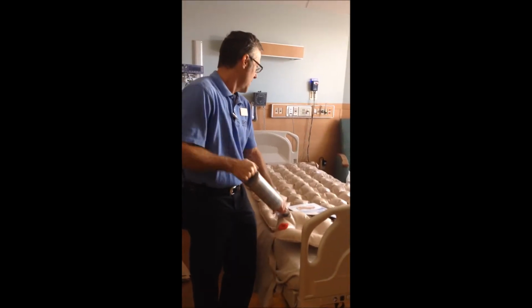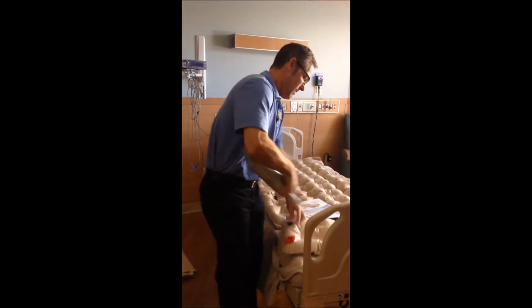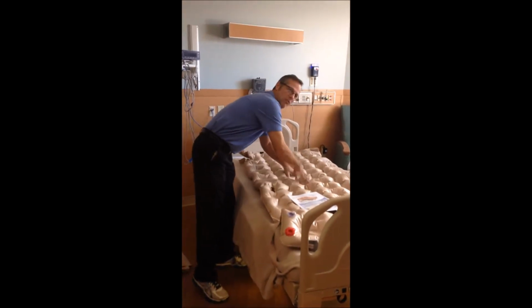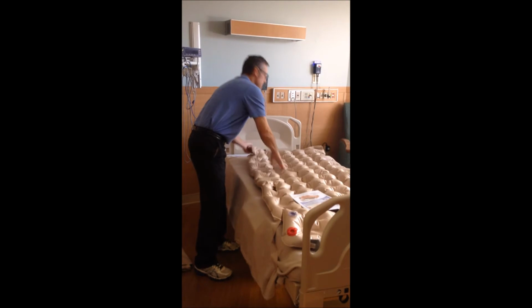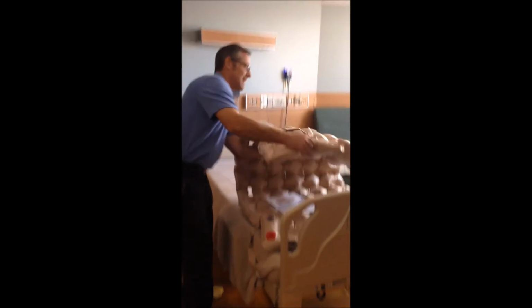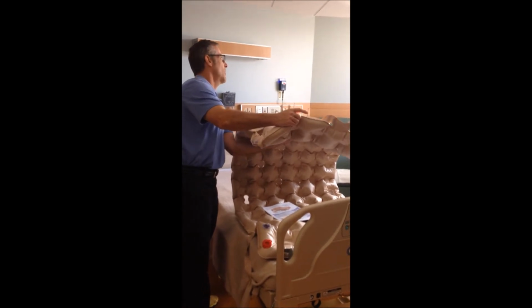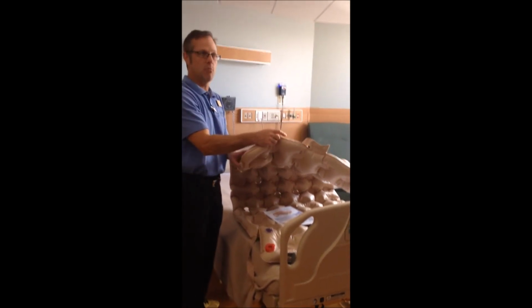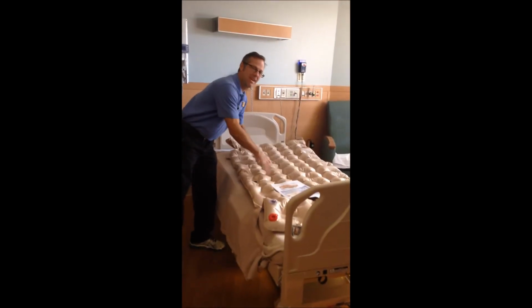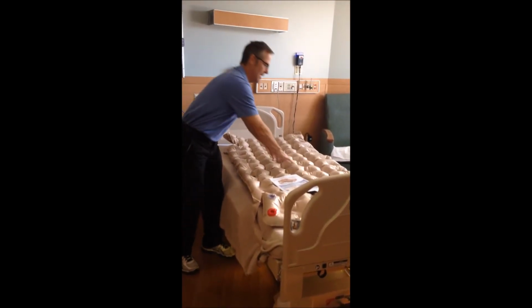Fold it in half, and I'm going to show you why. You want these nice and soft, just soft where it's nice and pliable. You fold it in half, and that's how it should lay. If it laid like this, there's way too much air in it. You don't want these to look like pool floats. You want them to be nice and soft. You want the patient to lie in the air, not on top of it, but in it.